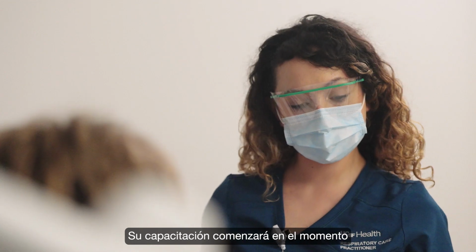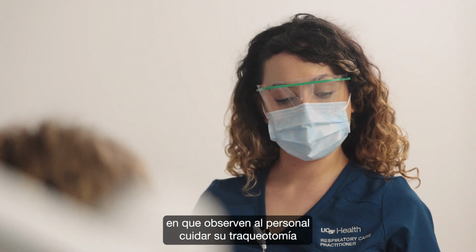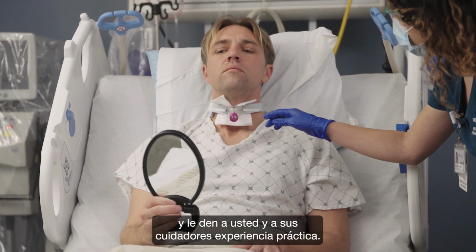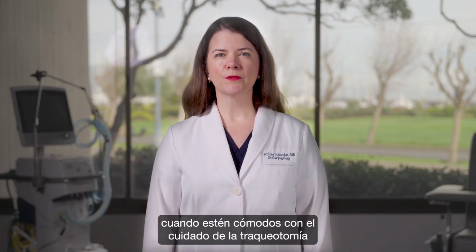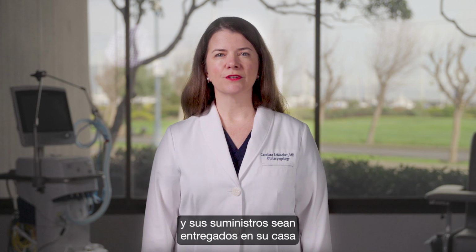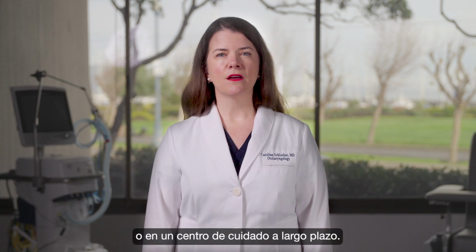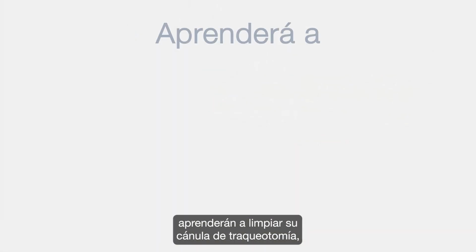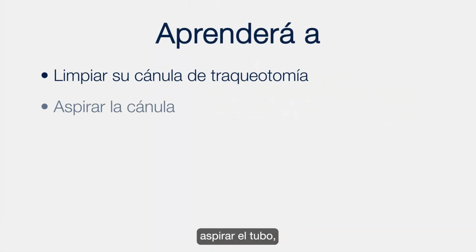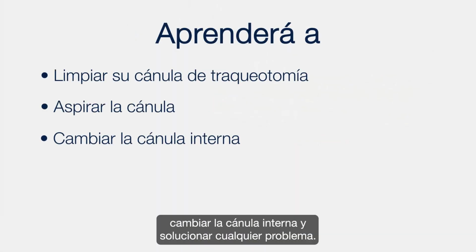Your training will begin immediately as you watch the staff care for the trach and give you and your caretakers hands-on practice. The training is complete when you are comfortable with trach care and your supplies are delivered to your home or, in some cases, a long-term care facility. Before you leave the hospital, you will learn how to clean your trach tube, suction the tube, change the inner cannula, and troubleshoot any problems.